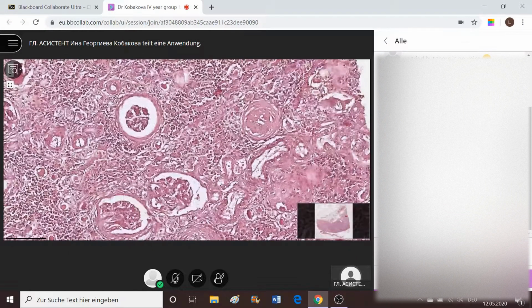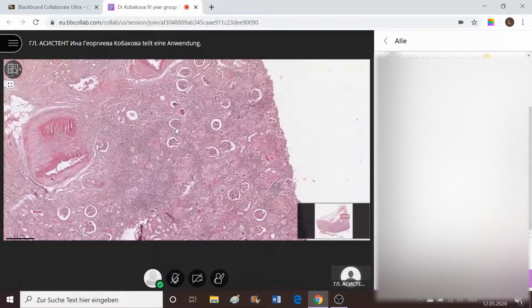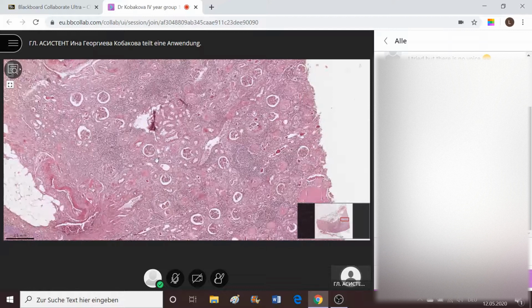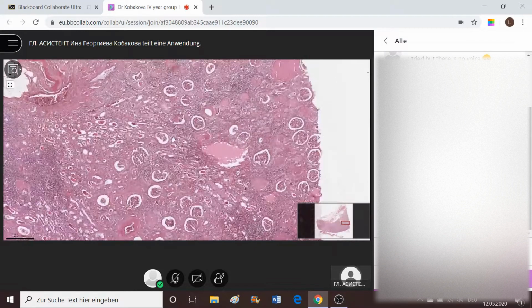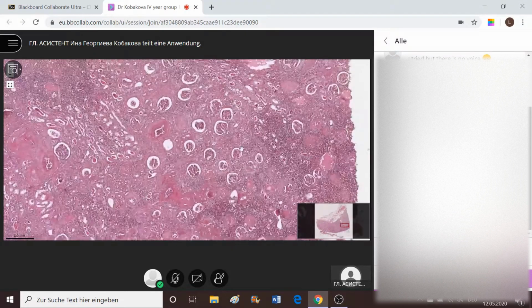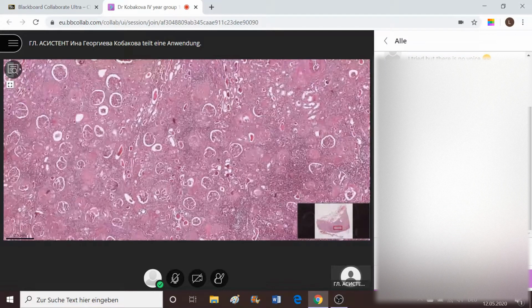If we take a look at a smaller magnification here, we can count that in such a field of a kidney, we can observe a couple of glomeruli which are kept healthy and others which are completely hyalinized. Approximately, this is about 50–60% of the parenchyma, which is completely dysfunctional, which leads to the idea that this kidney might be starting to suffer renal failure.